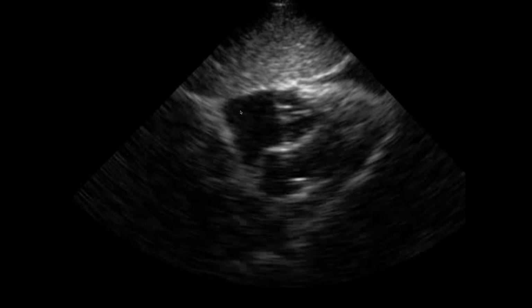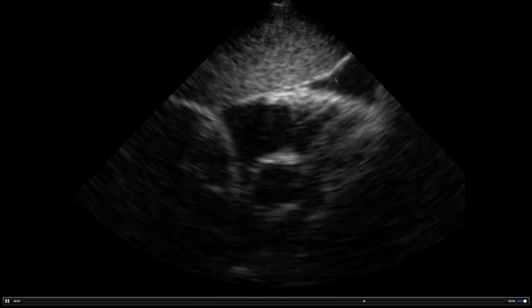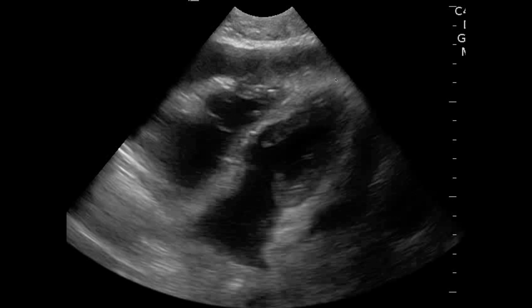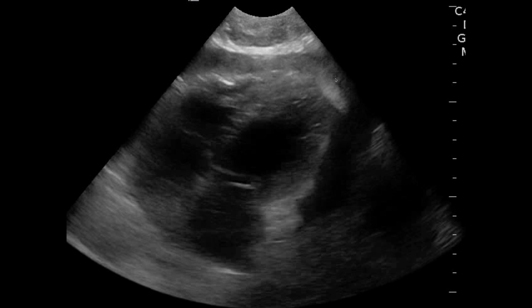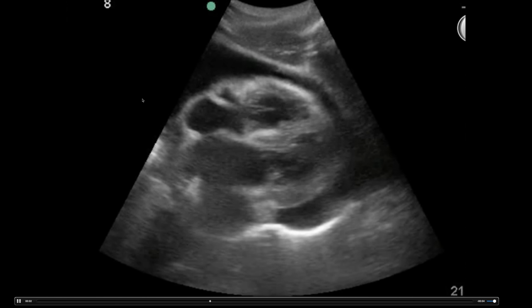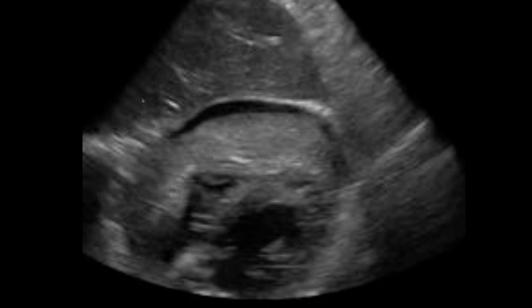Positive subxiphoid views. We went over effusions. Here's your black effusion, anechoic. Effusion above the pericardium there. Another positive effusion. This is a trauma patient, so this is actually blood around the heart. Likewise, blood around the heart. Again, as you see more and more of these, you can see how you can easily pick them up. It becomes very much pattern recognition.